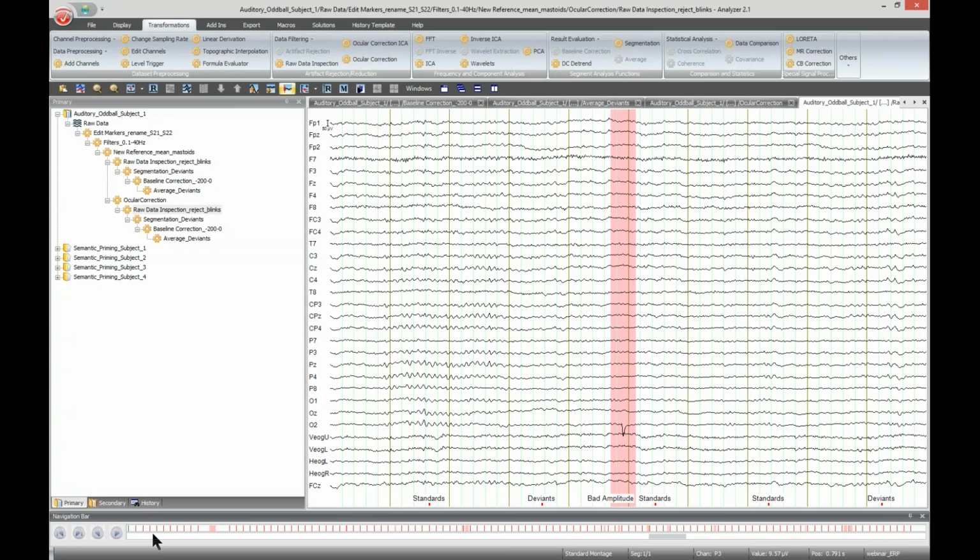Okay, generally it makes sense to consider such strategies to attenuate artifacts by mathematical means, unless you have a very large number of trials where you can easily tolerate losing a couple of them. However, more trials also means a longer recording time, which also means there are potentially more artifacts. In the end, a very similar situation could come up with large trial numbers.